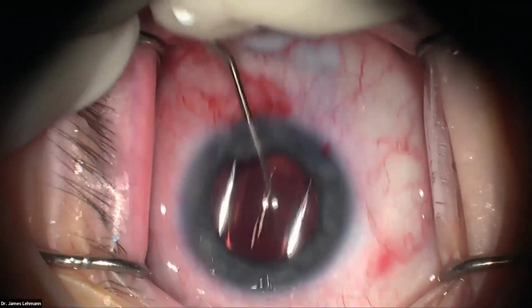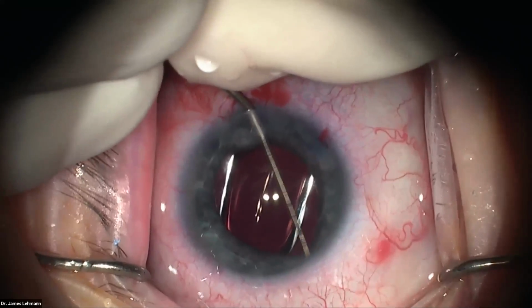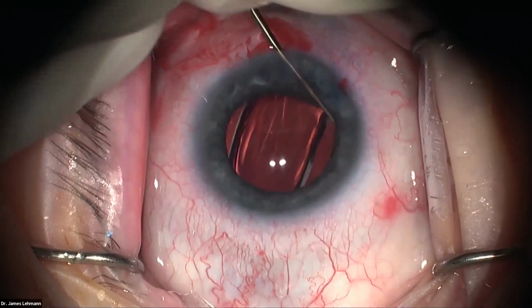Now, again, with the Femto, it's nice because you know you got a 5mm rhexis. So I'm going to just move the iris around a little so we can make sure we didn't have anything hiding back in those parts.